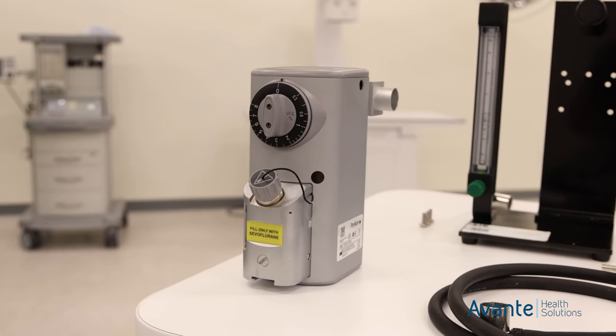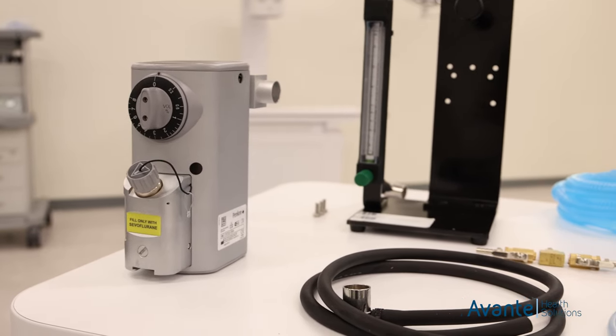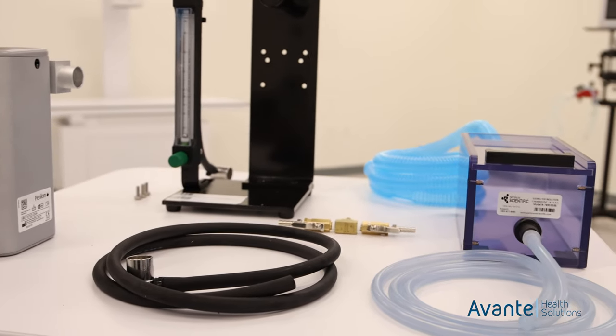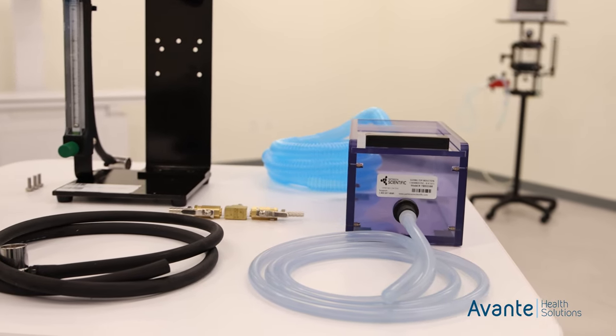The Compact Mini for rodents and small animals is a non-rebreathing system that includes an O2 hose and O2 flow meter. It's easily adapted to most induction chambers. It includes a handle and is lightweight, making it easy to transport between departments and can be customized with multiple flow meters.